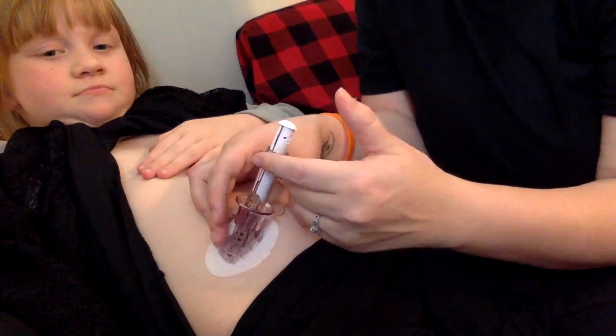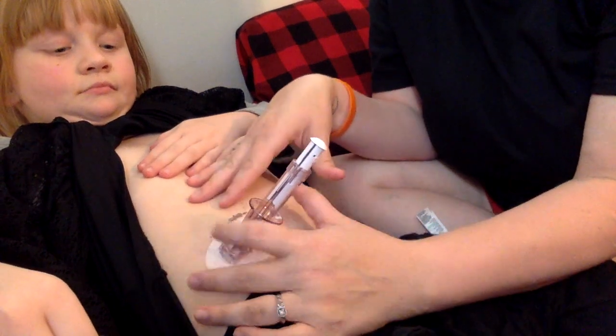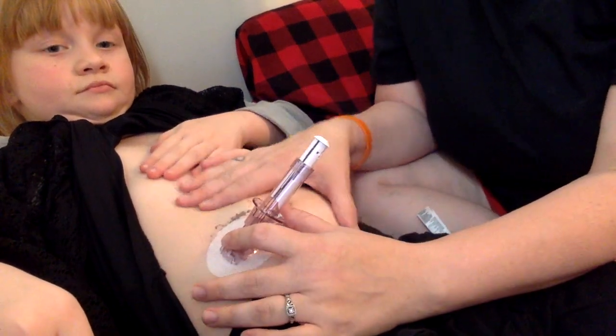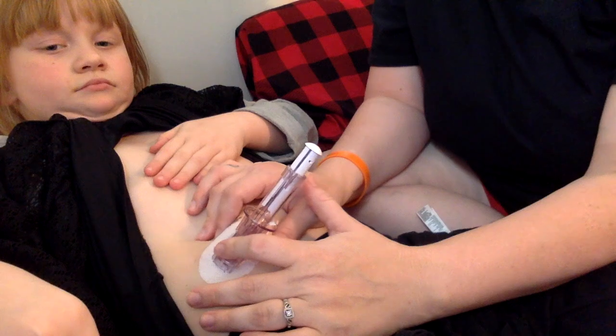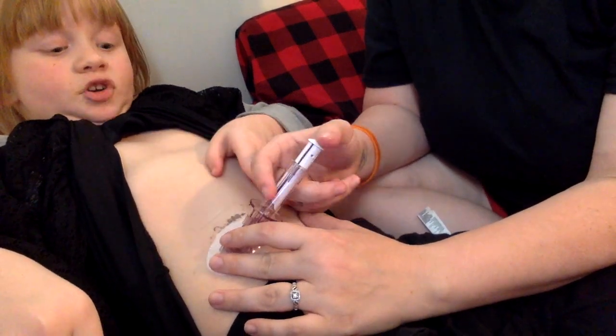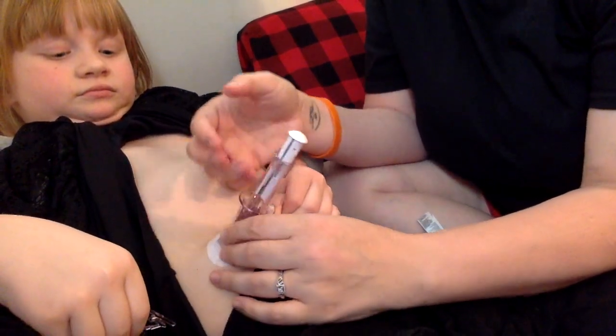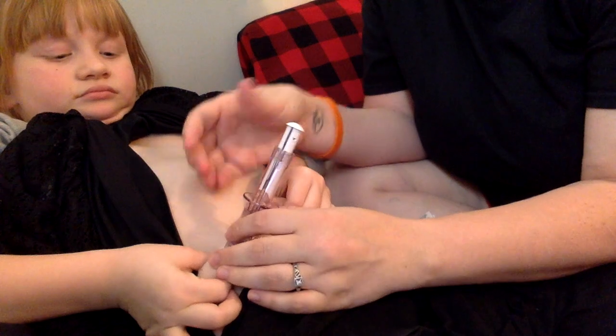Okay. So the first step is you pinch up a little bit, especially where she's so thin and has very little meat on her stomach. You want to push up a little bit so it has more to go into. And then... It's not push. I know. You squeeze, okay? There you go. Okay. Not so much. There you go.